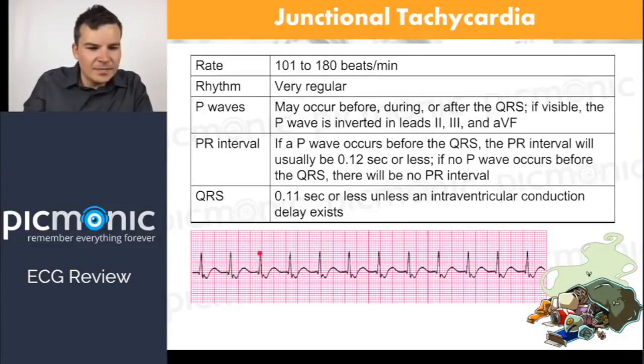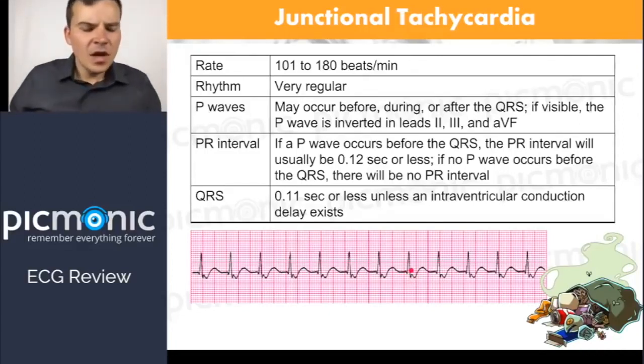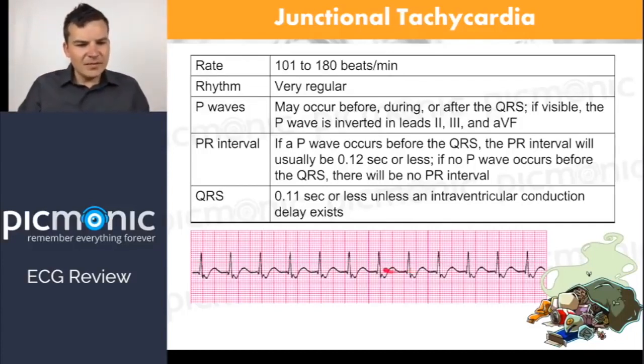So we're looking at PQRST, PQRST, and then just some madness down here, right? The P wave is actually occurring down here. But when you look at these, so many people get confused and get hung up, like, well, which one's the P? What you should be able to do is identify the QRS, right? If you identify the QRS, then you know that the P should be right before it and the T should be after it. Sometimes it requires a little bit of guesswork, but you end up getting the hang of it, of just understanding that there should be a P wave right here causing this. Maybe you would say that little notch, no. So there's the QRS, and then remember, coming back above the isoelectric line, here's our T wave. So this is just a PQRST. This is actually a hidden P wave down here, at the same time as the S.